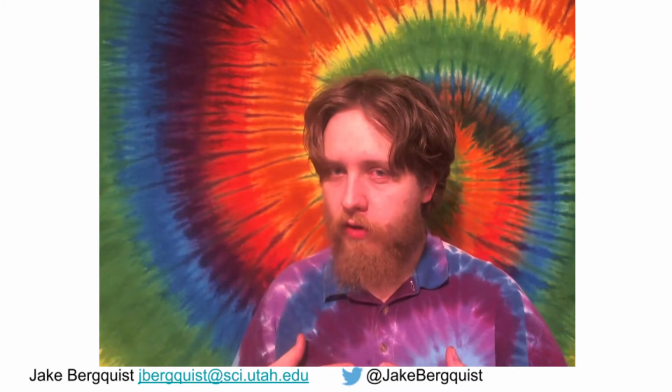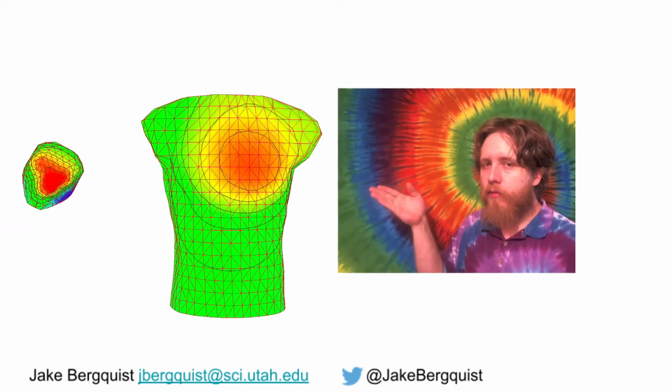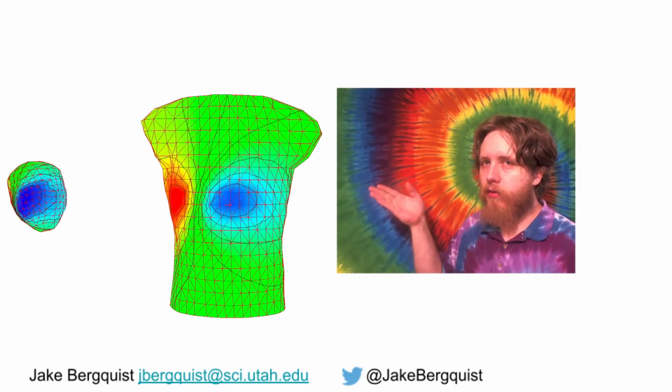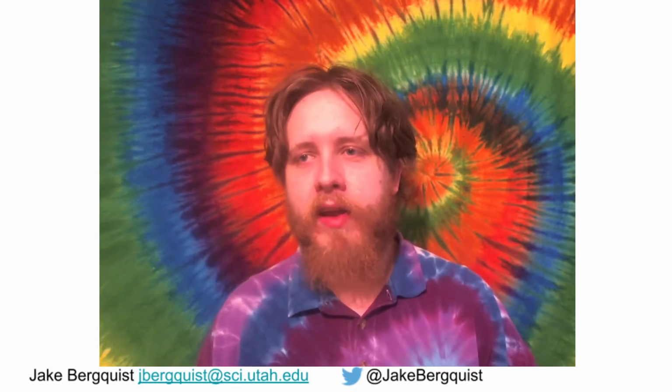There are several different sources that could cause geometric error during either an experimental preparation or a clinical setup. For example, when the patient breathes, their heart is going to move as their chest expands and their lungs fill. Remember, as we saw here, movement in the heart can cause differences in the torso potentials that may not be accounted for in the geometric model if it's based off of a single static image. These geometric errors can be quite difficult to correct using procedural changes. For example, it can be difficult to attain additional imaging that captures the motion of the heart, and it can also be impractical to require that the patient or subject maintain some sort of breath hold procedure during recording.